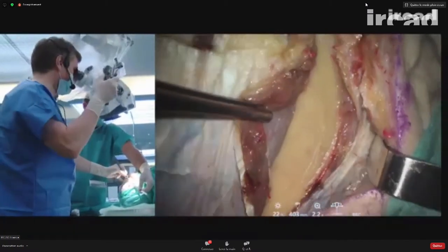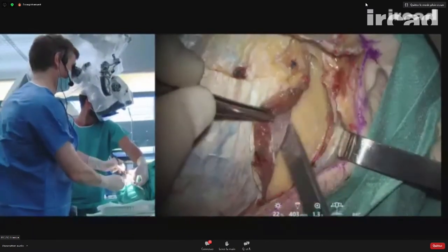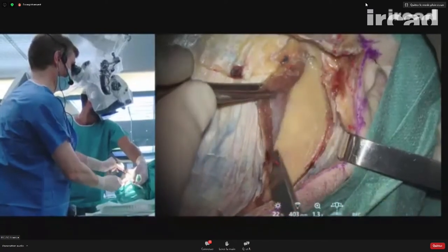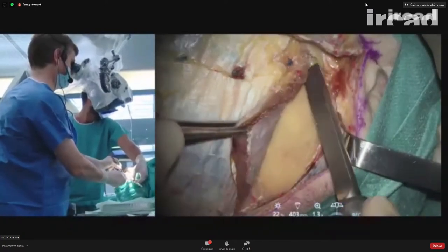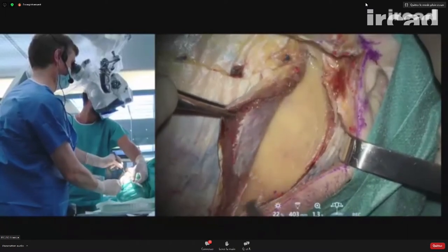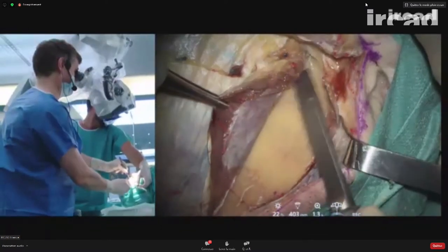No power in your instruments is mandatory. It's not something for which you need strength. But what I want to keep is this white layer.